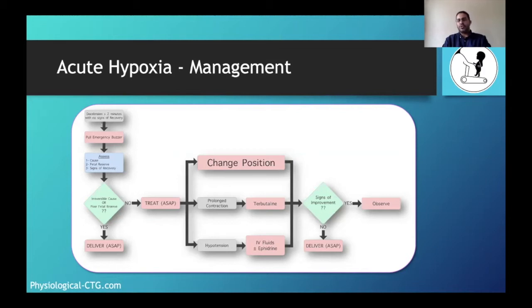And they're just watching because, oh, the baby is improving. We keep on watching. And then they realize 5-6 minutes later that actually, no, the baby was not improving. There were no signs of improvement at all. The baby's actually really hypoxic still. And now they've lost valuable time.